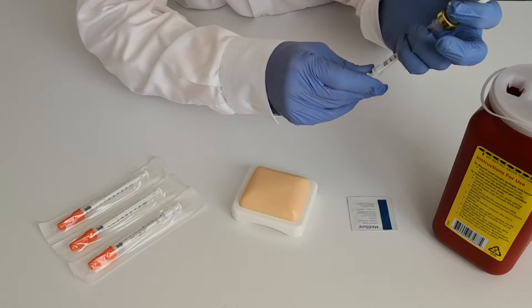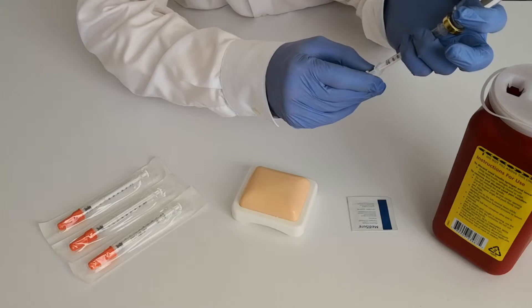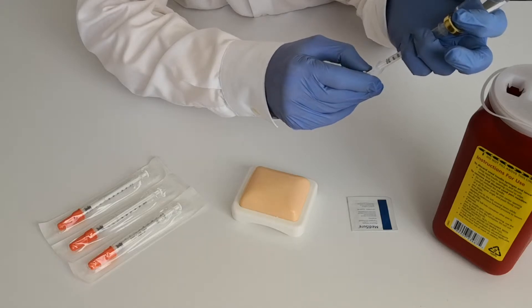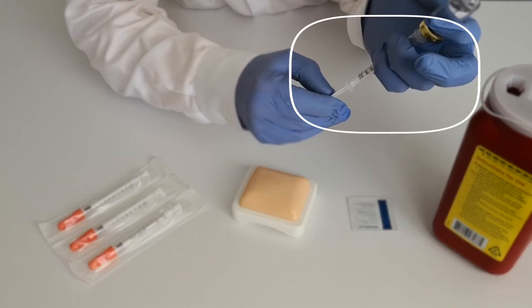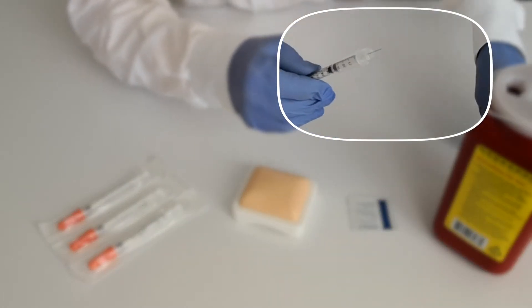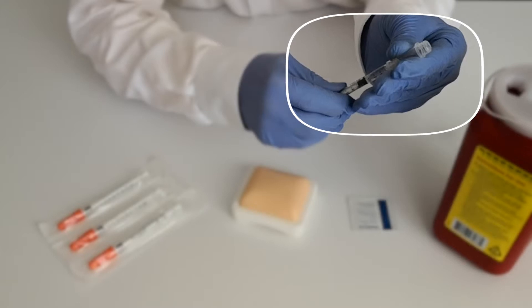At times, you may need to prepare a syringe outside of the patient's room. With One Care, you can temporarily shield the needle while you transport it to your patient. To engage the temporary transport mode, slide the safety shield forward over the needle until you hear a click. Now you know the needle is protected while you take it to your patient.